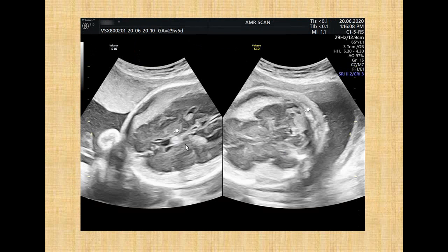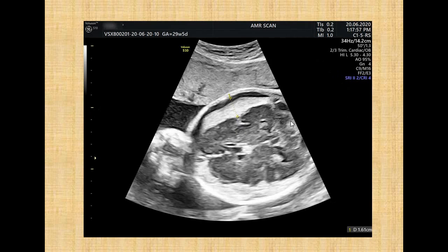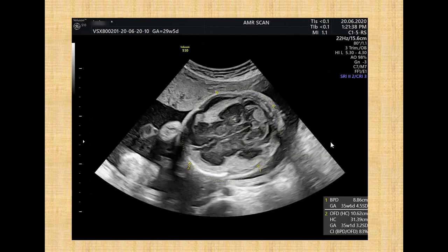Also, there is a hyperechoic focus noted at foramen of Monroe, and also the right cerebellar lesion is well seen here, with leveling of the extraaxial collection seen at the right cerebral convexity. Here also the extraaxial collection at right frontoparietal region. Also there is hyperechogenic focus at fourth ventricle, and there is mild asymmetry at basal ganglia bilaterally, suggesting possible right caudolentiform hemorrhage.